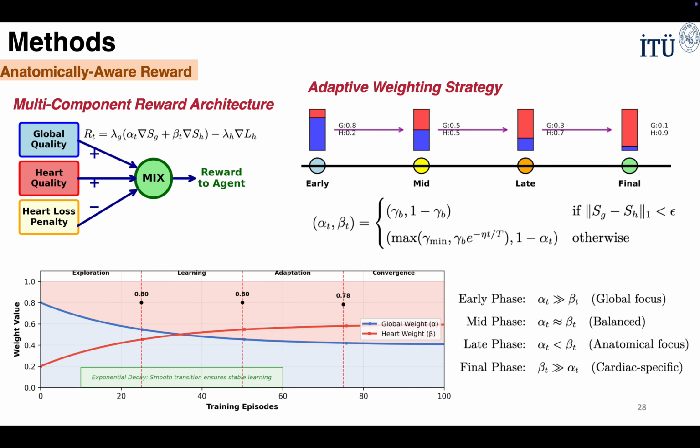The bottom graphic shows the progression over 100 training episodes, where the global weight decreases while heart weight increases, creating a natural curriculum learning approach that mirrors clinical diagnostic workflows.